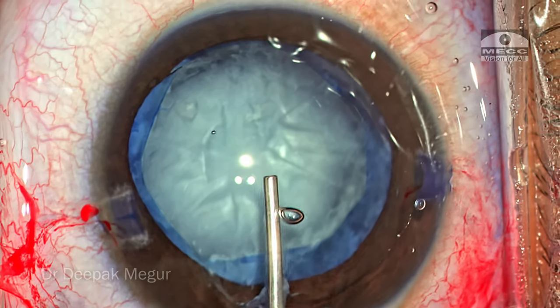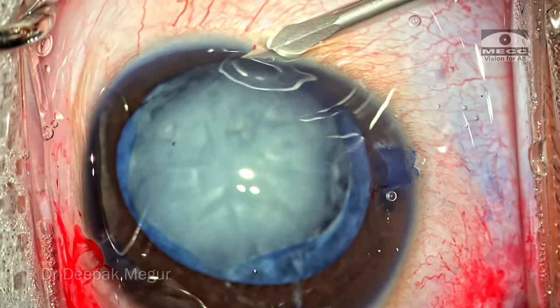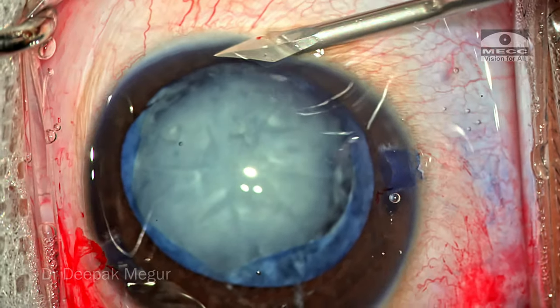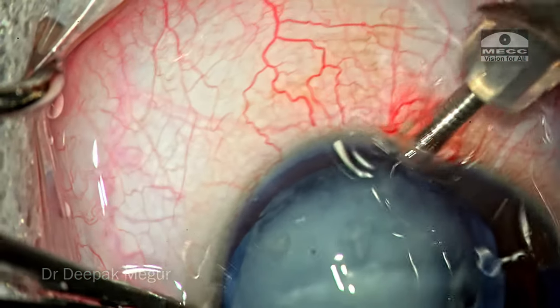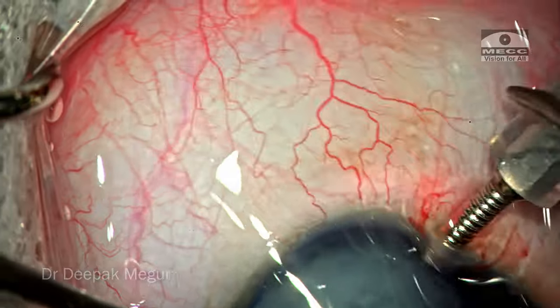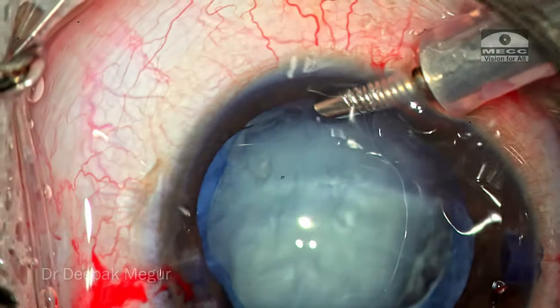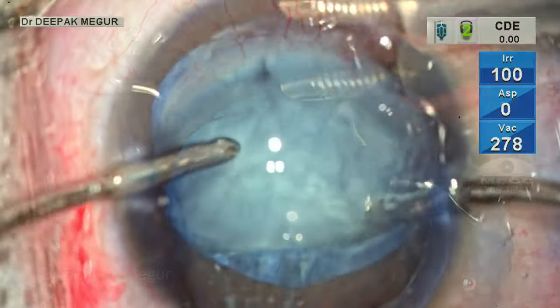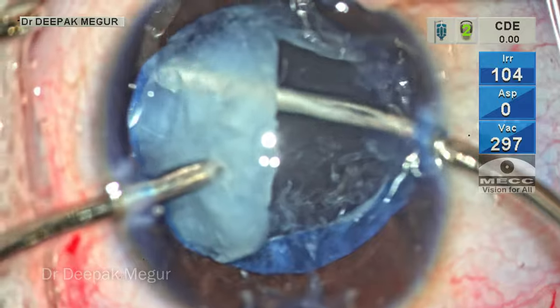Once the most important step is done, the rest of the steps are very easy. In this case, I'm going to use an AC maintainer since I'm planning to do an anterior vitrectomy. These are among the first few cases in which I'm trying the utility value of an AC maintainer when planning to open the posterior capsule and do anterior vitrectomy. I go in with my bimanual I&A to aspirate all the soft lens matter.